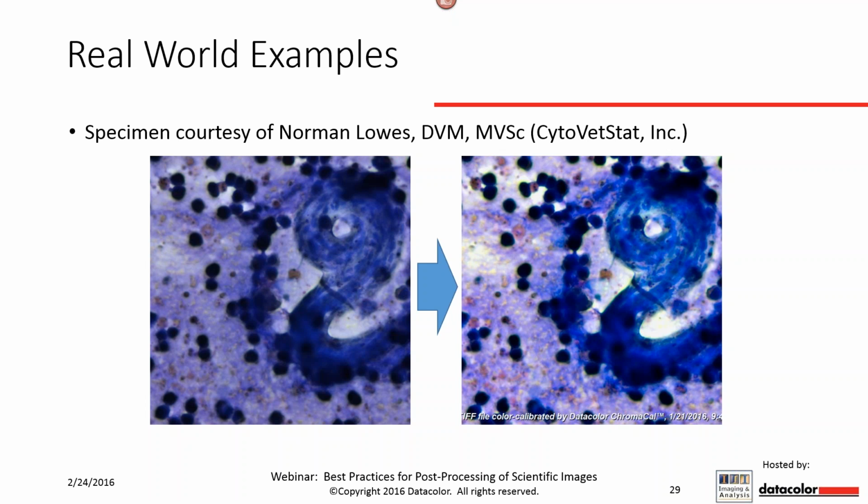Say, Mark, that this particular image makes me think of a study that was done where they found that pathologists could read slides digitally much faster when colors were more accurate. In this instance, using a monitor, it was a paper by Kropinski. They actually had almost a 30% increase in reading speed. So this is really nice to see something with that much detail.